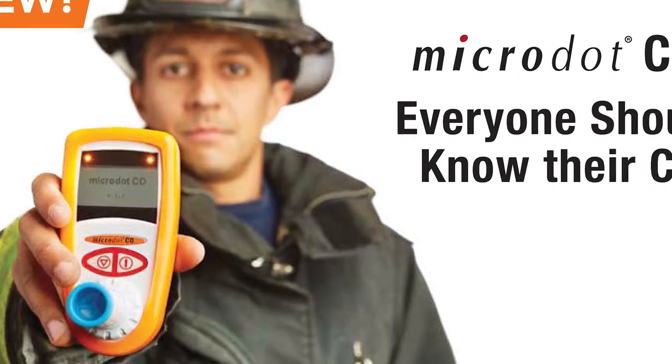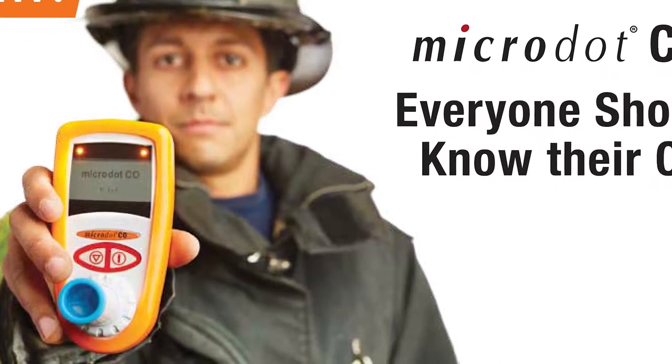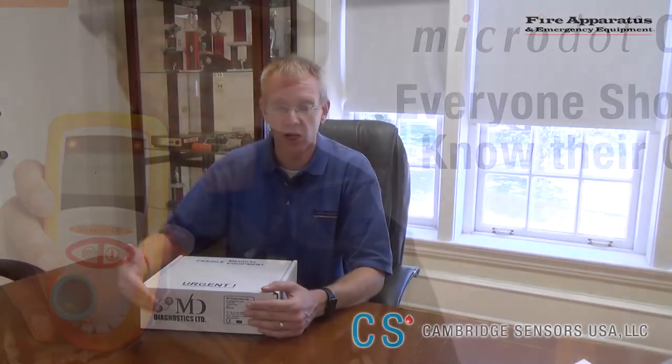A good time to test for CO is in conjunction with other parts of rehab after a fire, like when you use cleansing wipes, when you decon, when you're doffing your turnout gear. This is a breath analyzer.